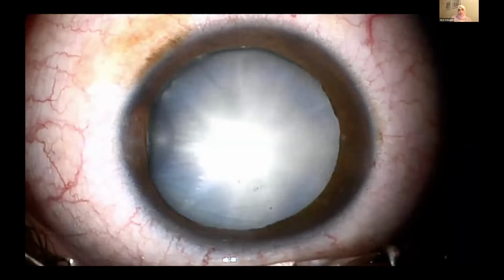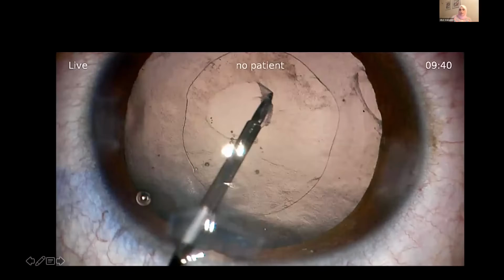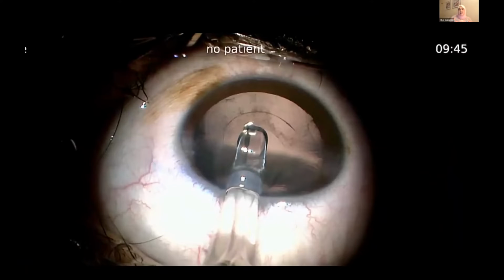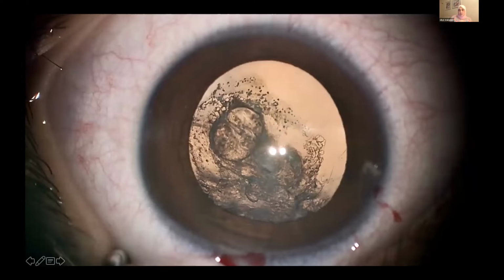In cases with a peripheral posterior capsular defect, we perform the posterior rexis in the conventional way, anterior vitrectomy, and inject the IOL inside the capsular bag, but care should be taken that the axis of the IOL should be parallel to the defect.